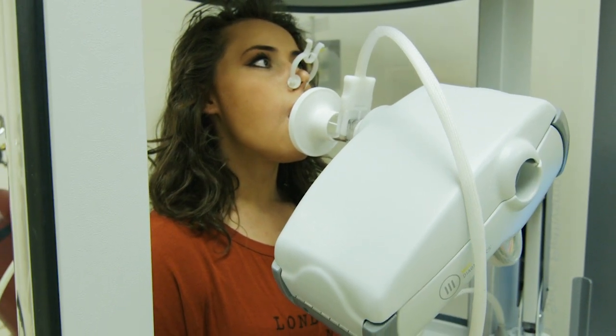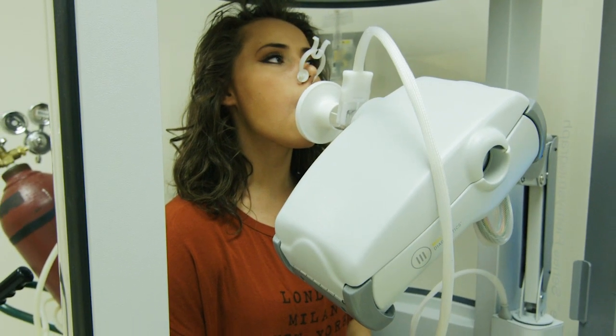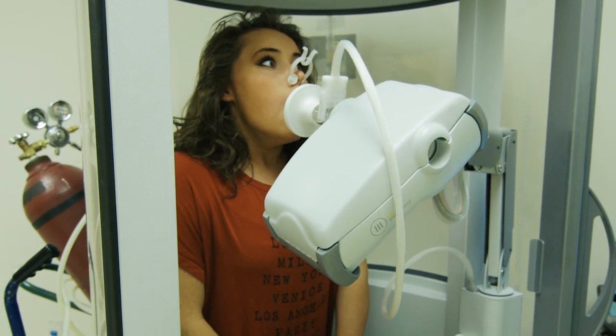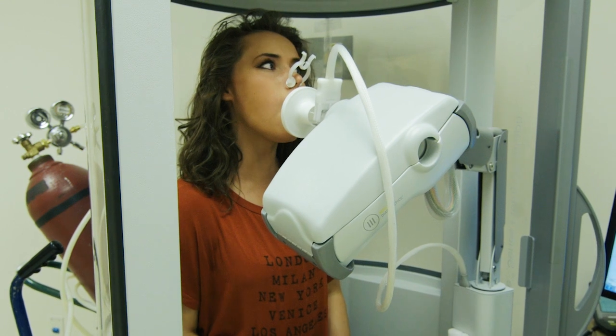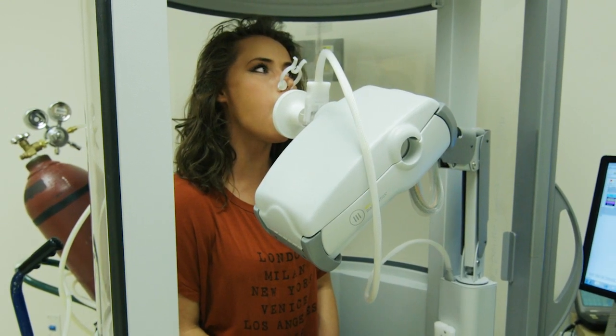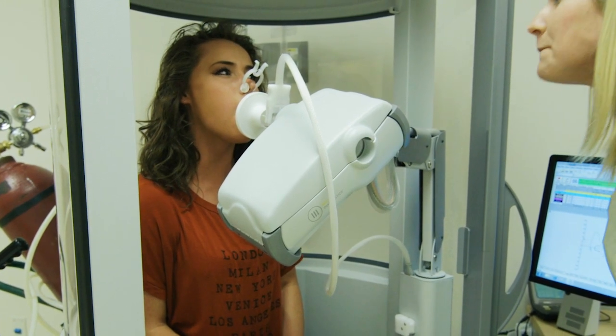Now blow out all the air in your lungs. Take a big breath in — even bigger! Now blast out the air as hard and as fast and as long as you can. Keep blowing until you cannot blow any longer!